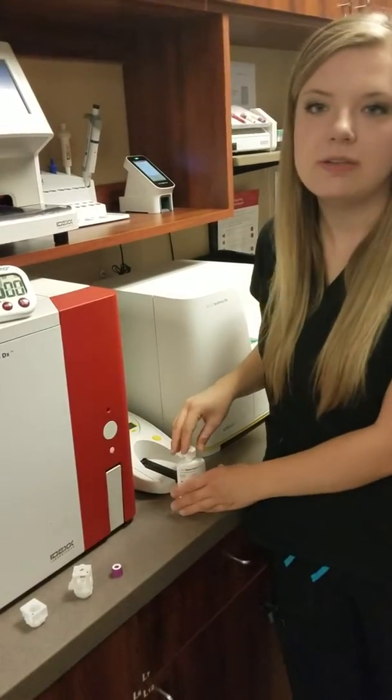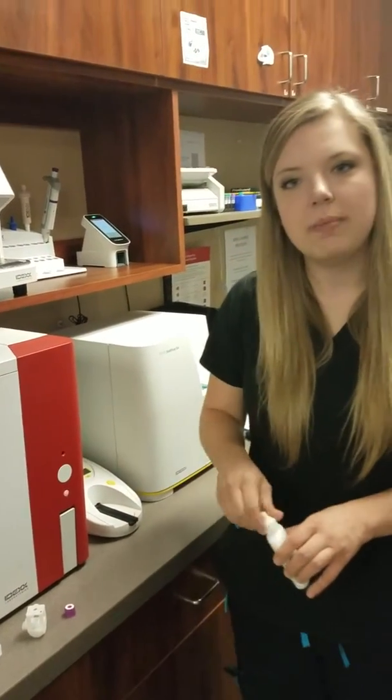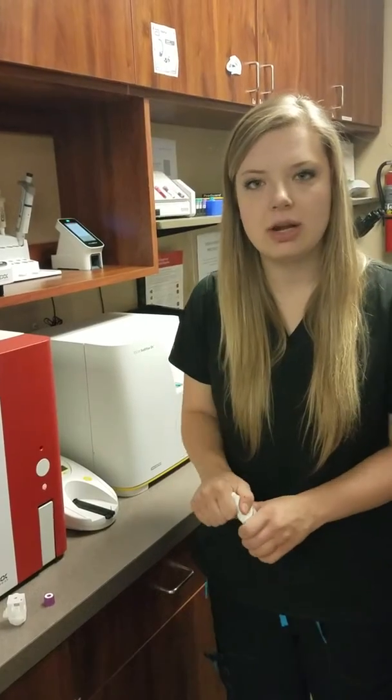This will take about 25 to 30 minutes. We'll come back 15 minutes through and set out our quality control.